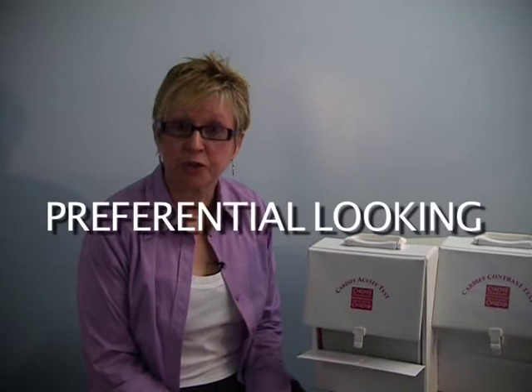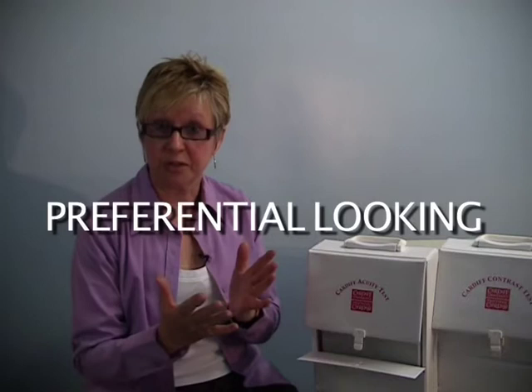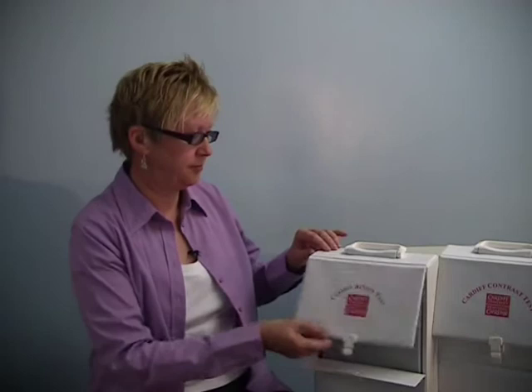The Cardiff tests use the principle of preferential looking. That means we rely on a child's or adult's eye movements to tell us whether they see the picture or not. It's a different technique to the usual way of asking a patient to name or match pictures, but it's a simple technique that's very easy to learn.